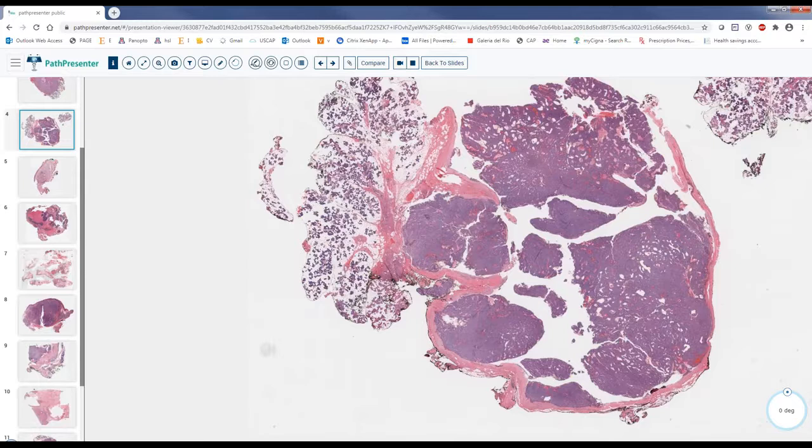The important question is to define basal cell adenoma versus basal cell adenocarcinoma, and this is with thorough examination of the whole capsule, and check if there is any vascular invasion or perineural invasion. Okay, so that's basically the important points we see in basal cell adenoma.